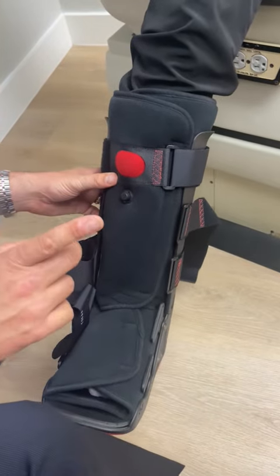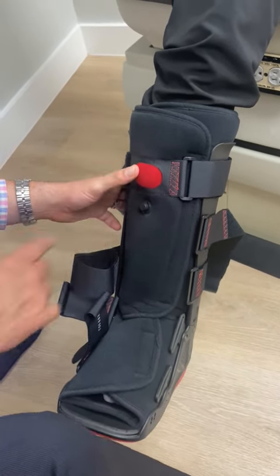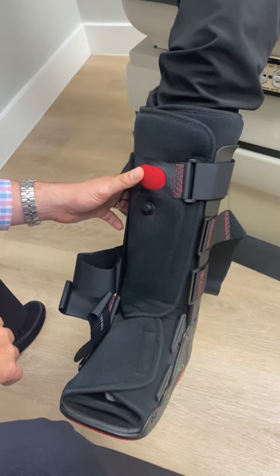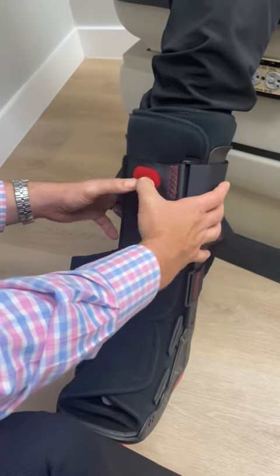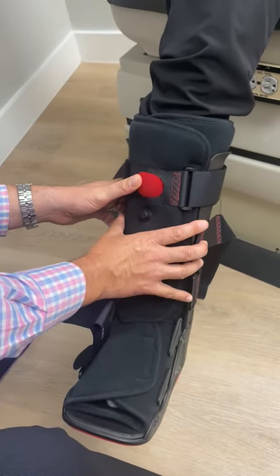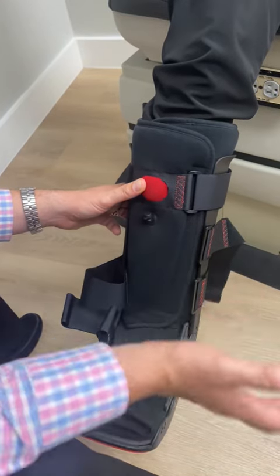The other thing I want to mention before we finish the strapping is the mechanism to actually push open and deflate. What you can do is go like this to actually inflate it, and you can start to feel the compression on the inside. And if you ever want to deflate it, you just open it back up and it lets the air out.